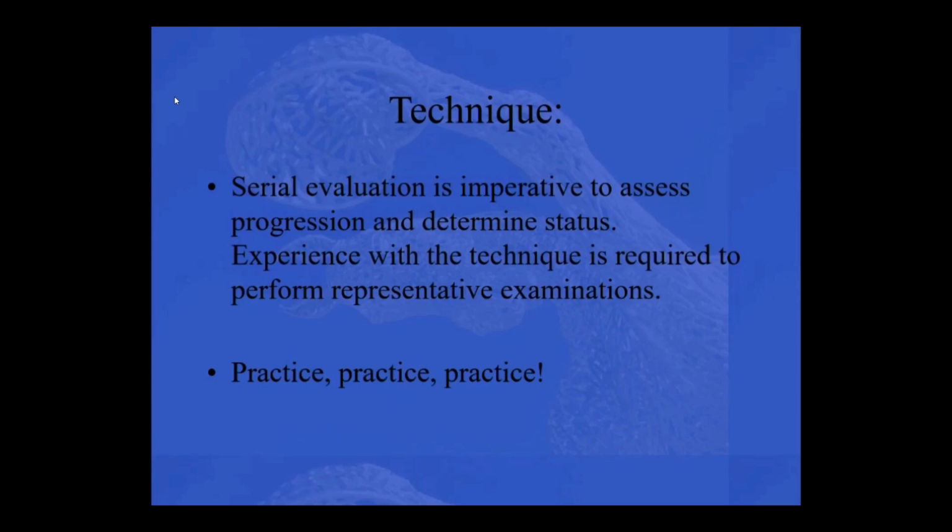What you will see is that if you do it once or twice, it becomes really difficult to do the same technique later back again and get a similar image. When I had my talk with my human client, a rheumatologist, I started adding it on nearly every imaging. It's not a lot, it's a couple of minutes extra. It gets me really good at making similar images over time, and you get a lot of extra data that you can store. I also have to say, quite often clients, if they're present with an exam, are quite impressed with just a 5-minute extra second pass, and they see all the colors and you explain to them what that is.